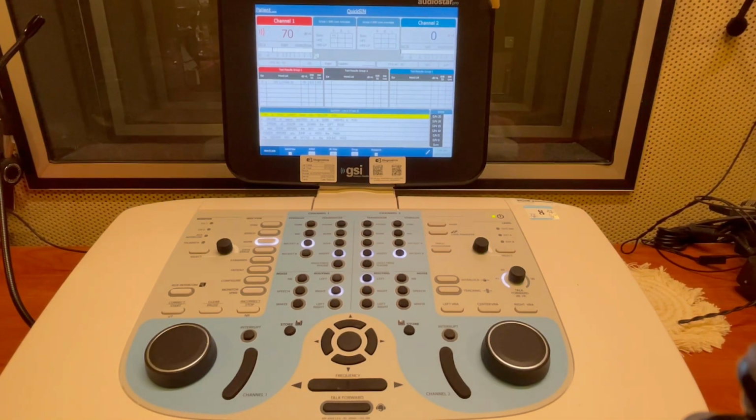So instructions for this test, I usually tell the patient, you are going to hear some sentences. There will be some background noise. Just do your best to repeat the words in the sentence back. You can extend that if you want to and tell them that the background noise gets progressively harder or louder. You can kind of keep it short and simple or as detailed as you want.